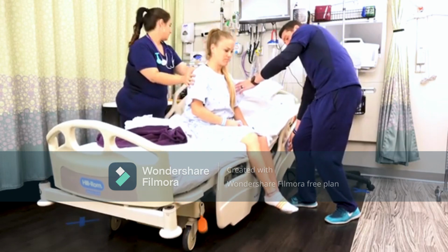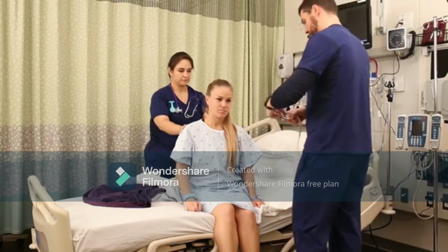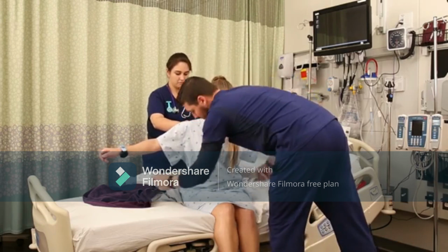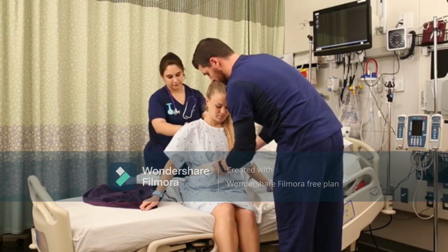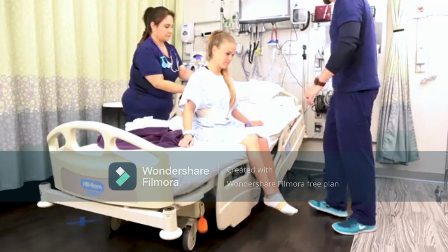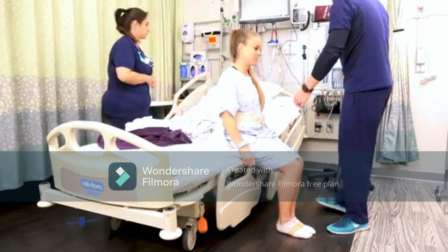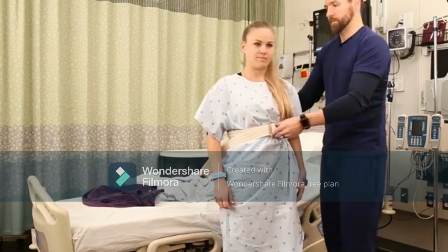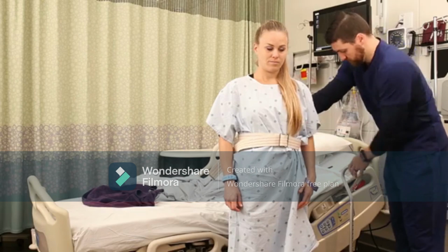Now at this point, if your patient might be a little unstable when they're standing, then you can go ahead and apply a gait belt for support. Remember, a gait belt should be placed just below the rib cage, tight enough to give you a firm grasp, but still loose enough to be able to reach your hand under and hold on to it. So once you're ready and you have your gait belt on, have your patient scoot their hips forward till their feet are touching the ground or a step stool, and you'll have them rock back and forth a few times for momentum and stand up tall on 3, pushing with their legs and keeping their head up. Now, once they're up, you can move on to the next task.